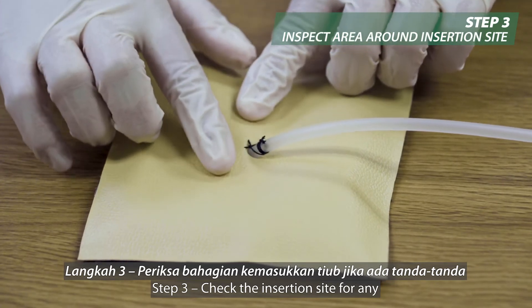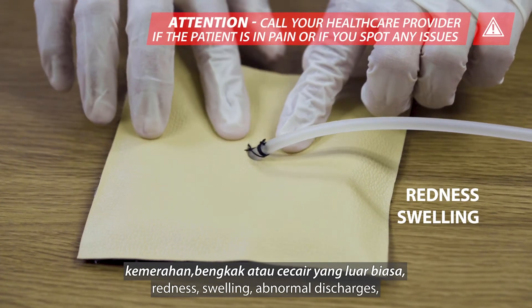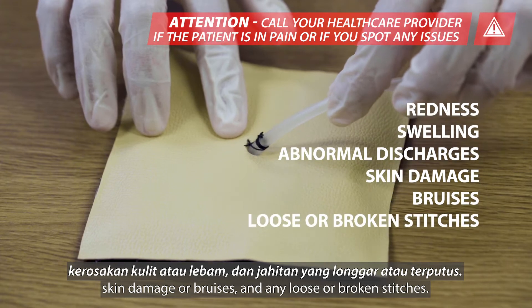Step 3: Check the insertion site for any redness, swelling, abnormal discharges, skin damage or bruises, and any loose or broken stitches.